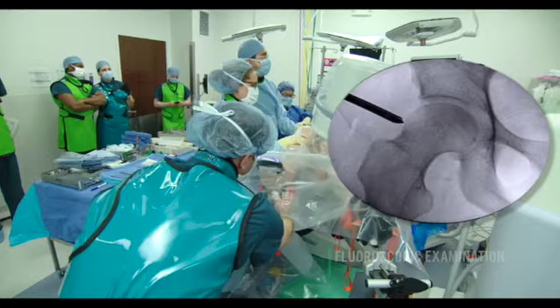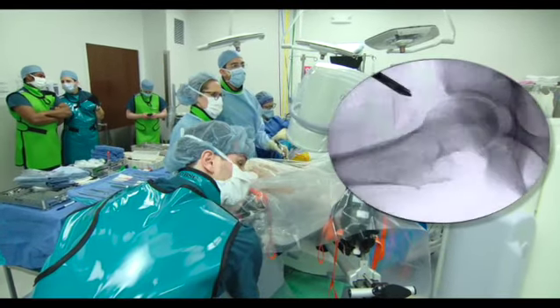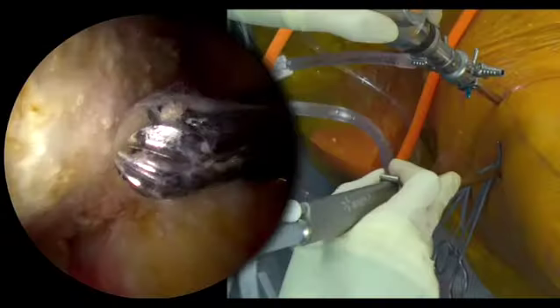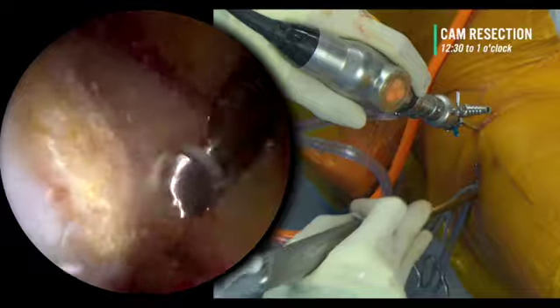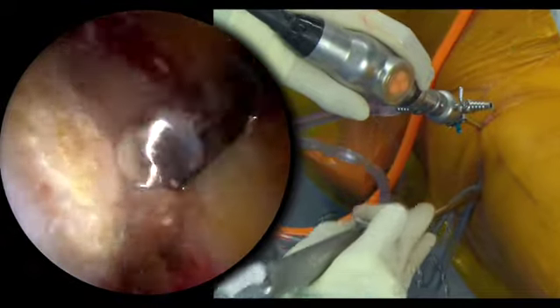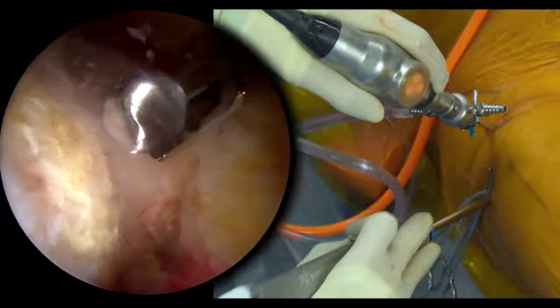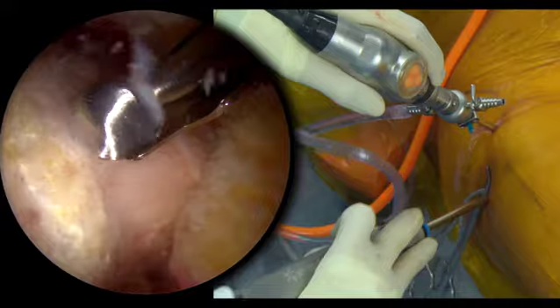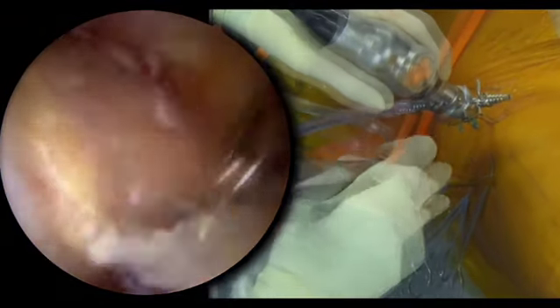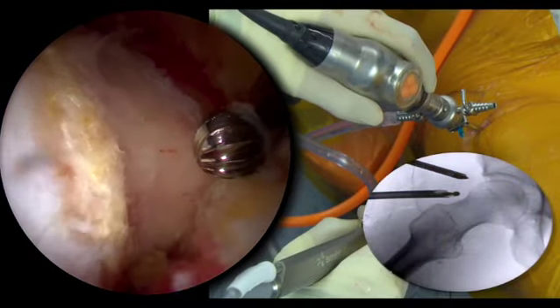The most lateral aspect of the cam lesion is resected in extension and neutral rotation, extension and 30 degrees of external rotation, and extension and 30 degrees of internal rotation, whereas the most anterior portion is assessed in 30 degrees of flexion in neutral rotation, 30 degrees of flexion, and 40 degrees and 60 degrees of external rotation. A 5.5 mm burr is used at this point to create a trough that will set the depth of the resection throughout the femoral neck.